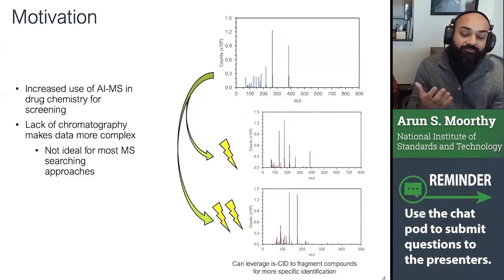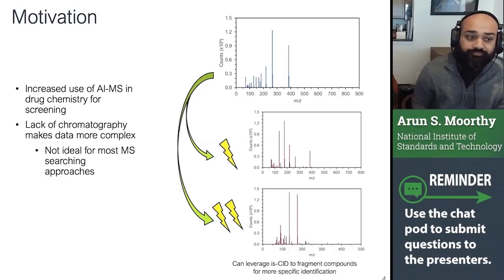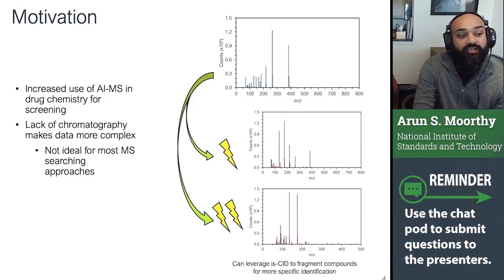So a little background about the functional research. Seized drug analysis is the most commonly requested forensics examination in the United States. Forensics labs are swamped with challenging case samples, and this has been the case for several years now. And so an appealing technology for these forensics labs is ambient ionization mass spectrometry.